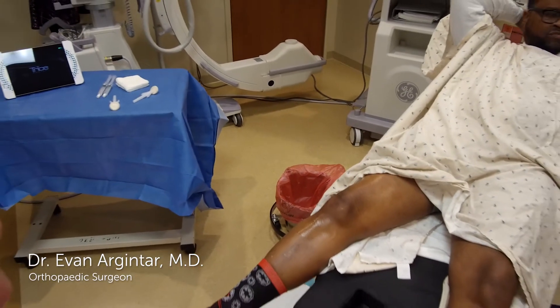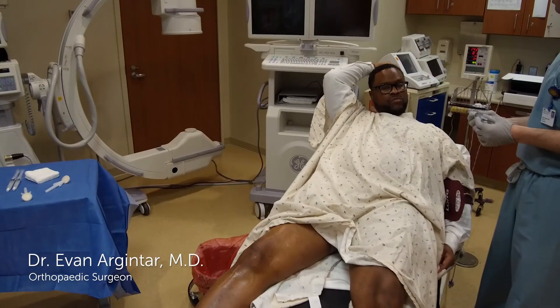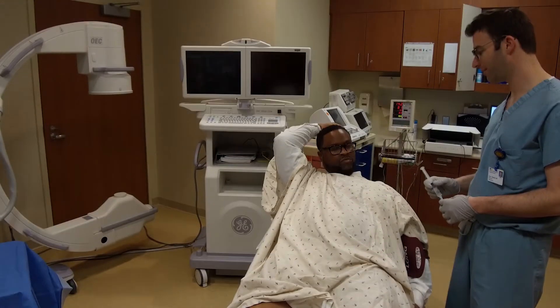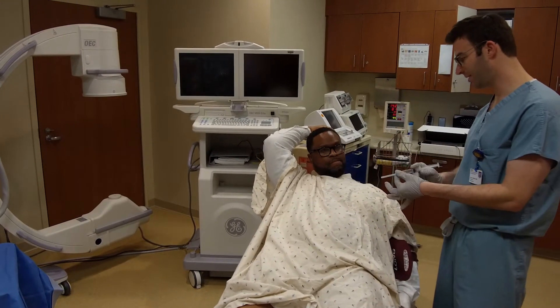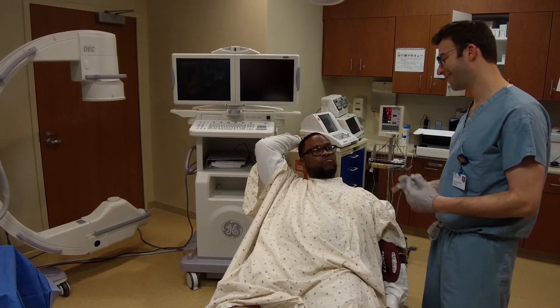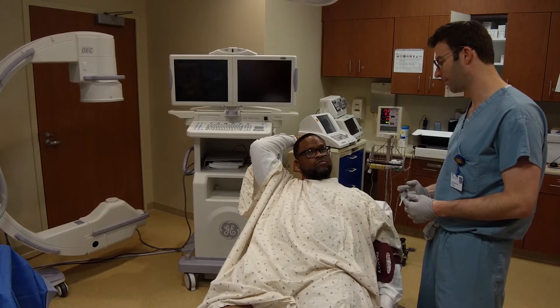So this is a local anesthetic. This numbs up your skin, like if you're going to the dentist — put it in there and numb up your tooth. That's all this is. So I'm going to put it in your knee, couple different spots. If you get a little burn, that's about it. And then it'll disappear. Come on back and then we'll get going.